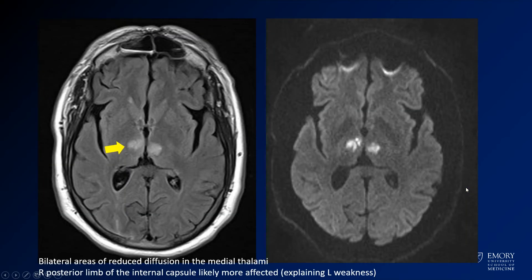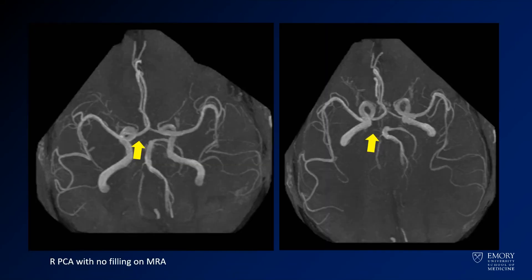In this case, you have abnormal FLAIR in the bilateral medial thalamus. When you look at the diffusion, you have abnormal diffusion in the medial thalamus, which suggests bilateral infarcts. On the MRA, there is an absent right PCA — the right PCA is occluded — which aligns with this because the right Artery of Percheron is occluded, as it arises from that right PCA.